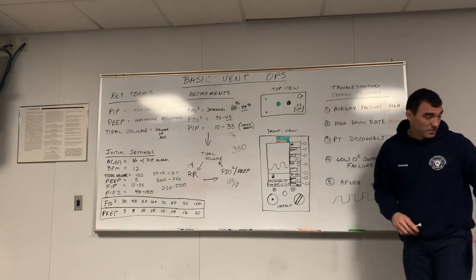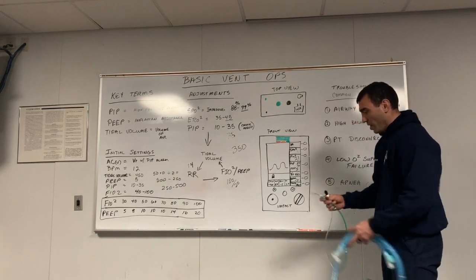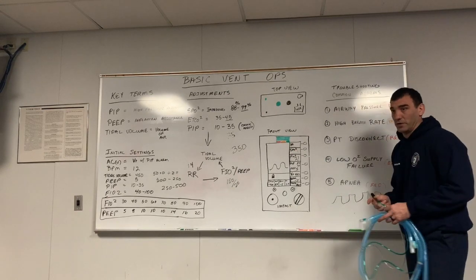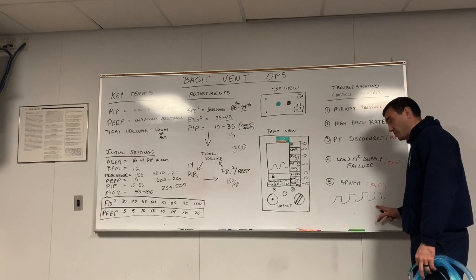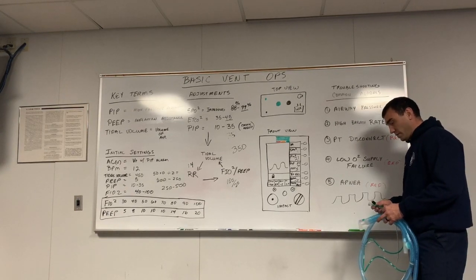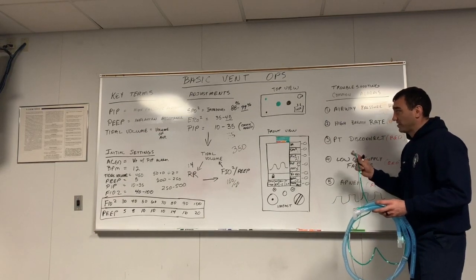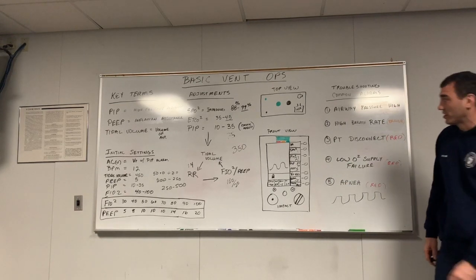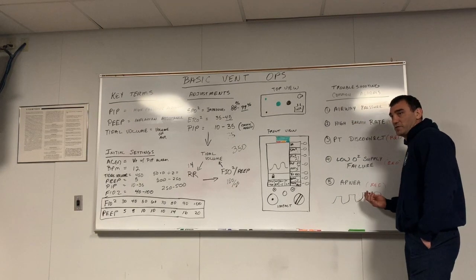If you disconnect one of your smaller tubes here, if you disconnect these on the top of your monitor, you can induce this alarm. So right away, when I have apnea, I check my end-tidal CO2 and make sure the ventilator is still working. If it is still working, to alleviate the alarm, recheck your tubing again and make sure these are connected. These get settings and let the vent know what's going on. So recheck those. If the apnea alarm continues, you need to disconnect the patient and use a BVM.